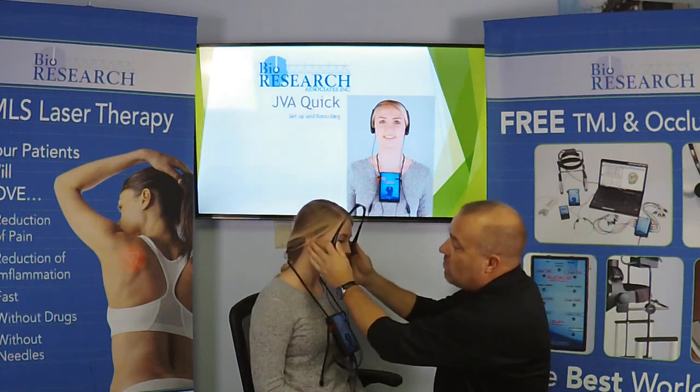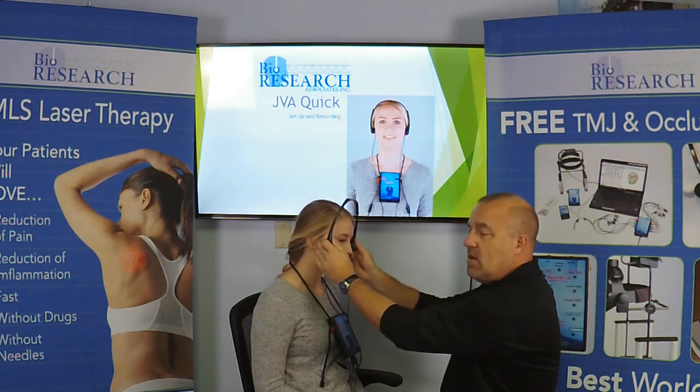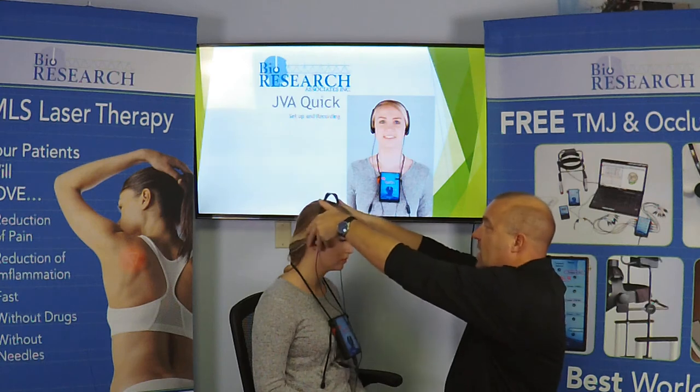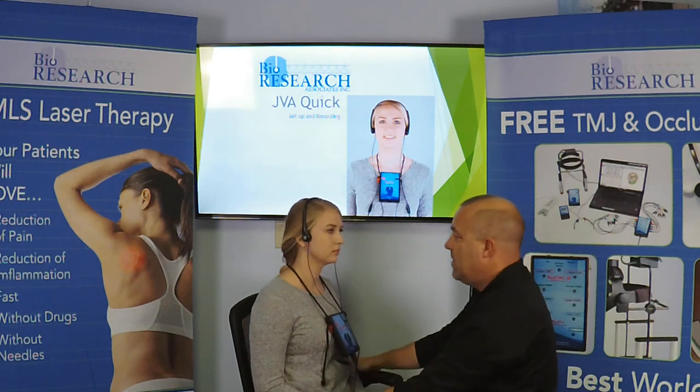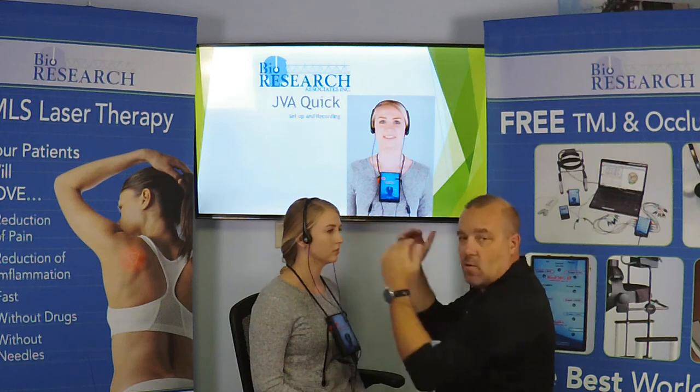All we're going to do is palpate right in front of the tragus, this little bump in their ear. We're going to palpate right in front of that, have the patient open, and I can feel the joint moving. And we just want to place the sensors right over the temporomandibular joint, and then with our thumbs, bring the headband down so it's nice and secure. We want to look at the patient straight on and make sure that we aren't real imbalanced with the way the headset is on the patient's head, okay? And we're ready to take our recordings. We have our patient's range of motion, so all we do once that is entered is we click OK.